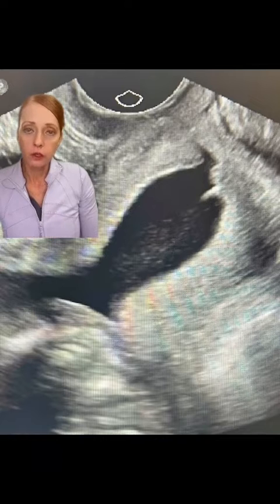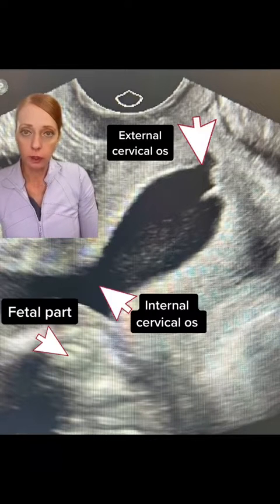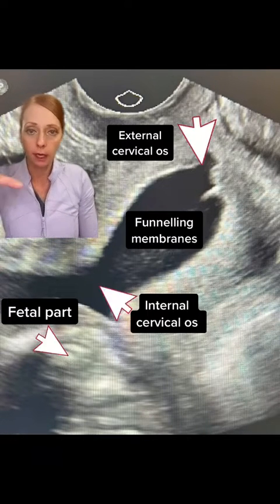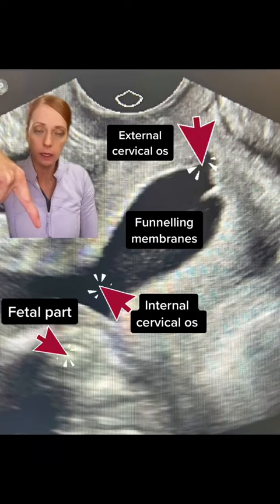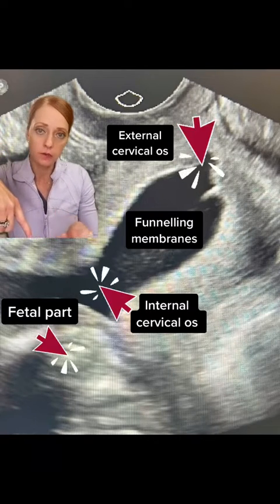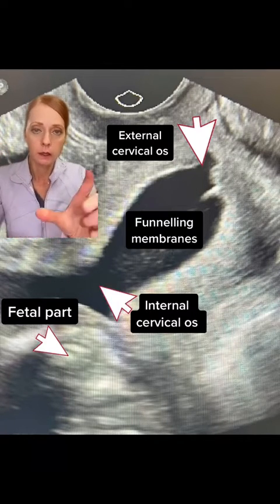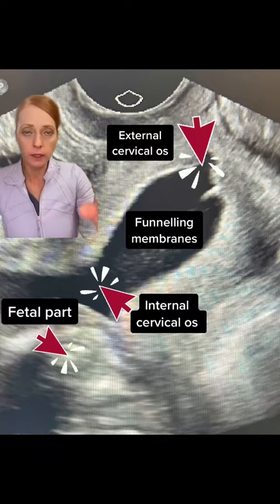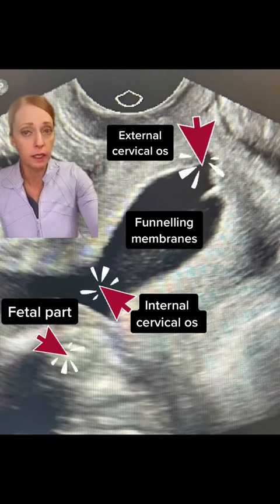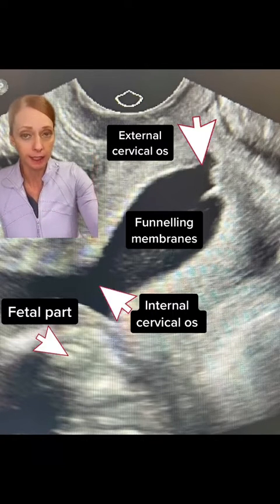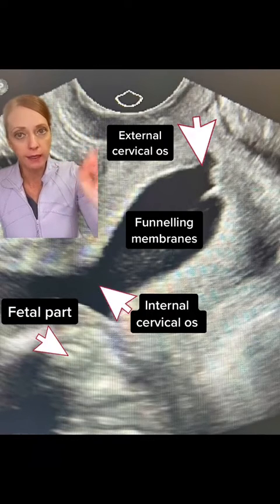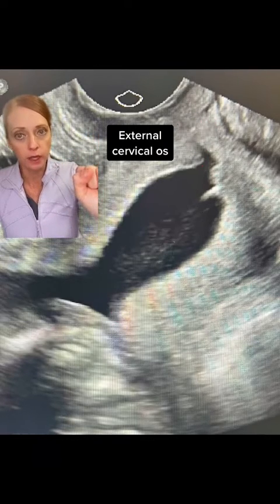So to confirm, we did a transvaginal cervical length screen to get a better look. And right here, down here is going to be the fetal part. Again, this is the internal cervical opening — the funneling of the membranes through the cervix. And it appears that the external opening of the cervix is dilated, with the bag of water right through or right at the external opening of the cervix.